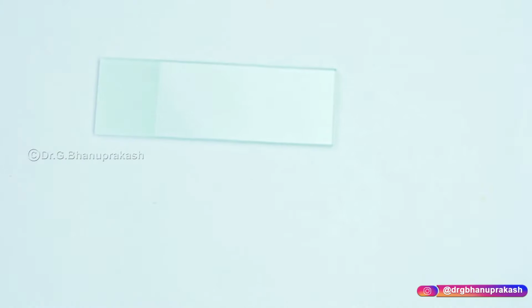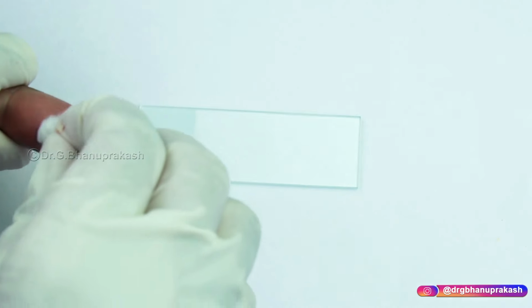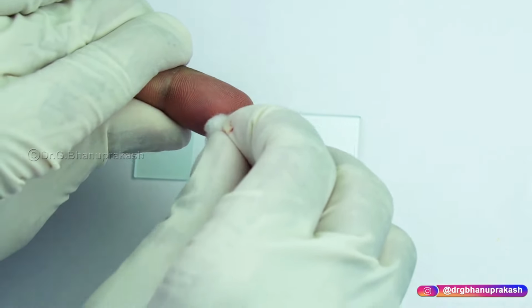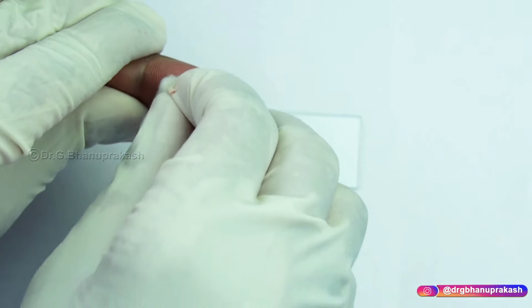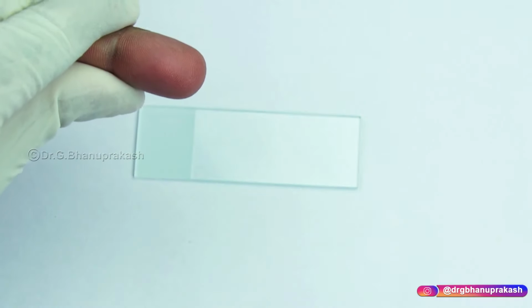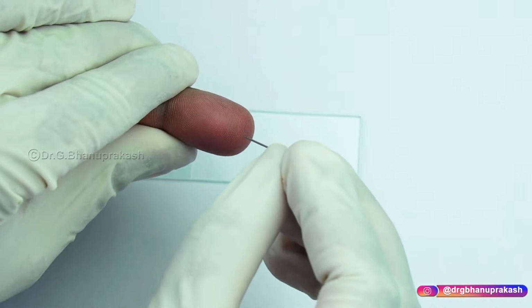Now I am educating the patient on the clotting time procedure, and now what I will be doing is I will take the patient's finger of choice. Now I will completely sterilize this area from center to periphery. For how much time? Obviously you have to do this for 30 seconds. Now I will take the pin. Now I prick the patient's finger.